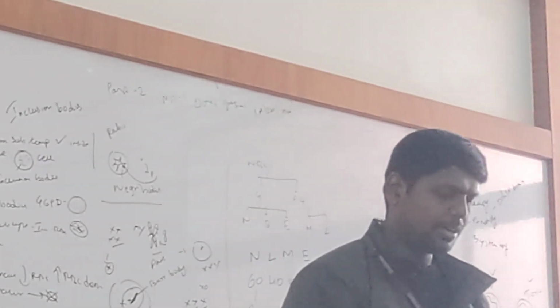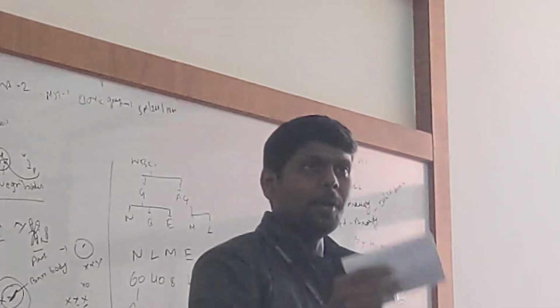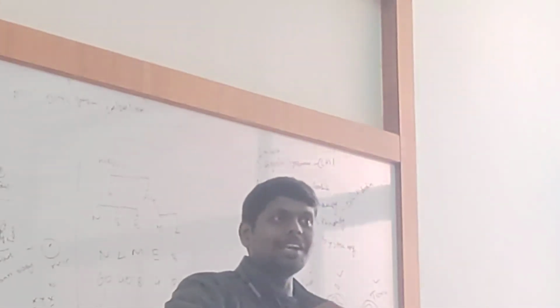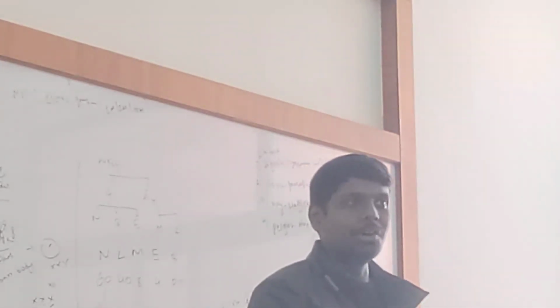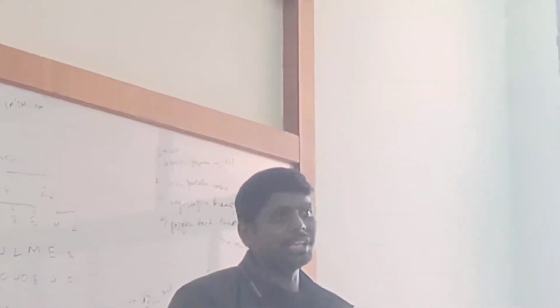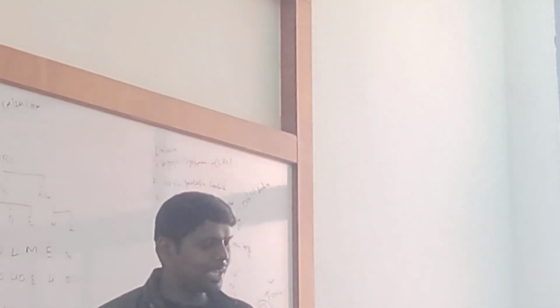Why do we say asymptomatic? Because in the DLC, it looks like pale neutrophils, and we will think there is a dye issue.